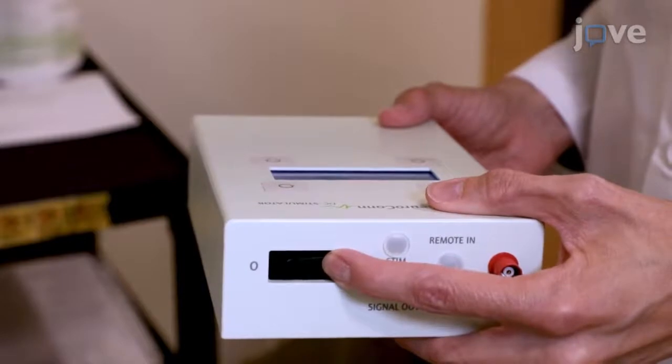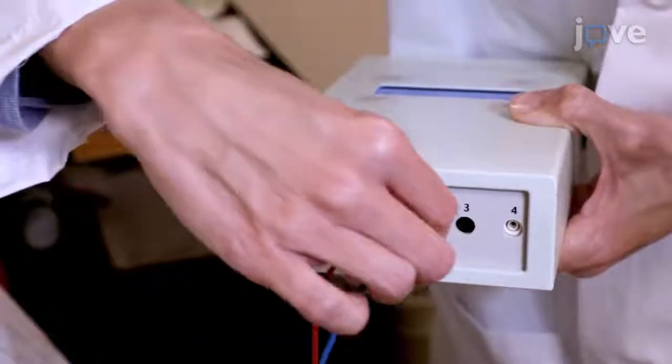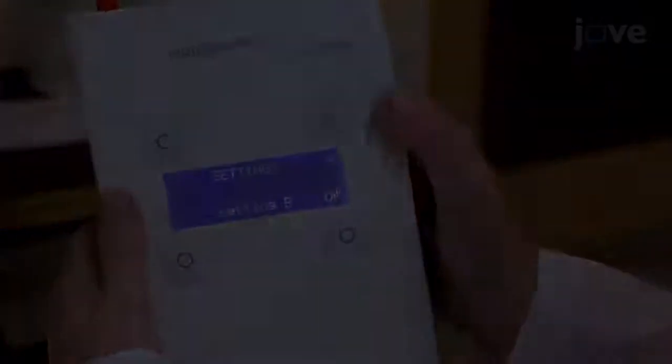When the electrodes have been placed, turn on the tDCS device and plug in the electrodes. To load setting A, press the top right button.